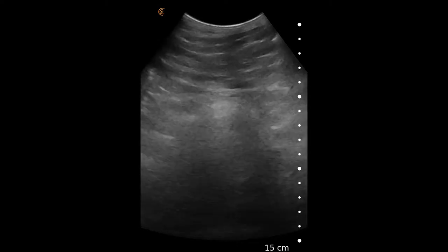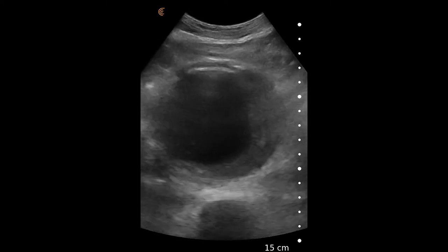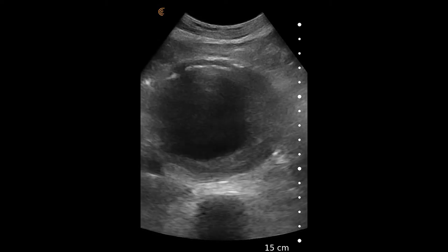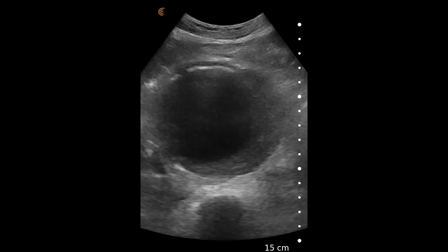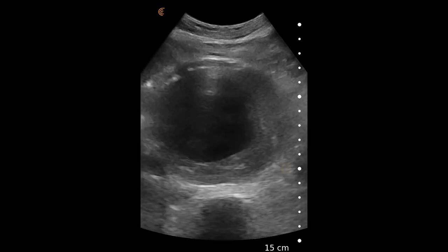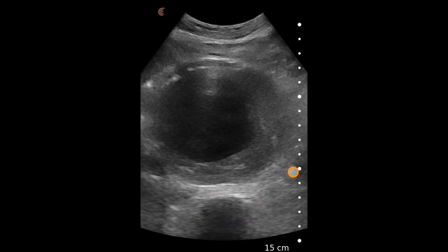In this video, we see a curvilinear scanner placed in the transverse orientation below the xiphoid process. The first landmark should always be the vertebral shadow, which is a bright white line deep on the screen that has shadowing behind it.